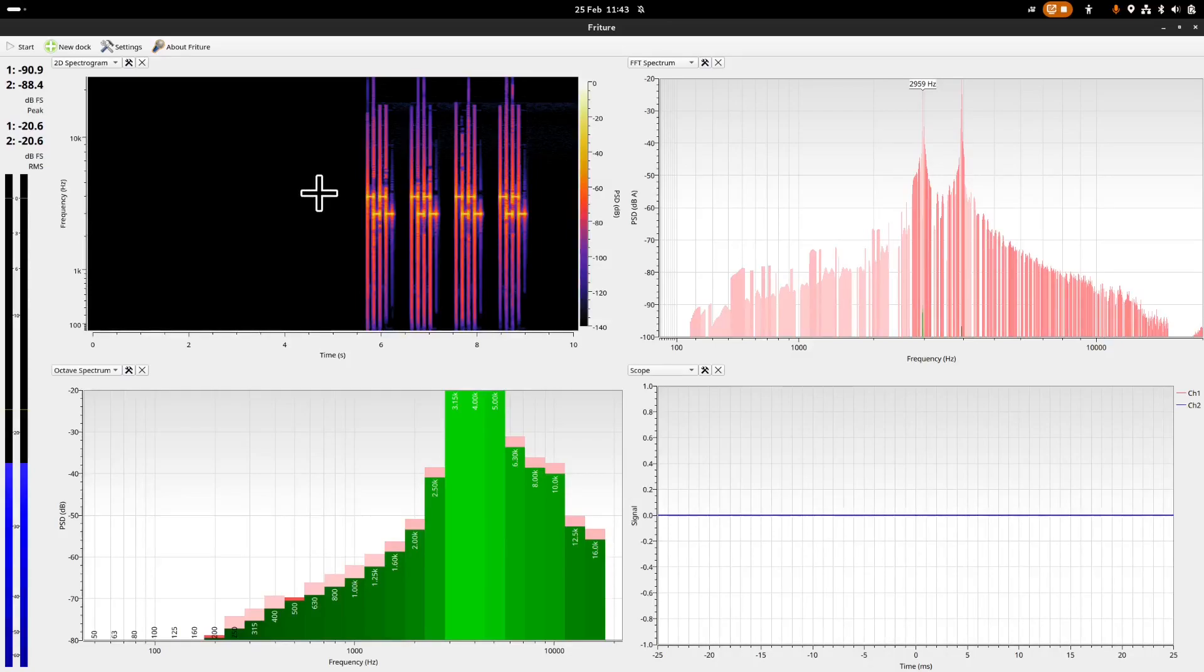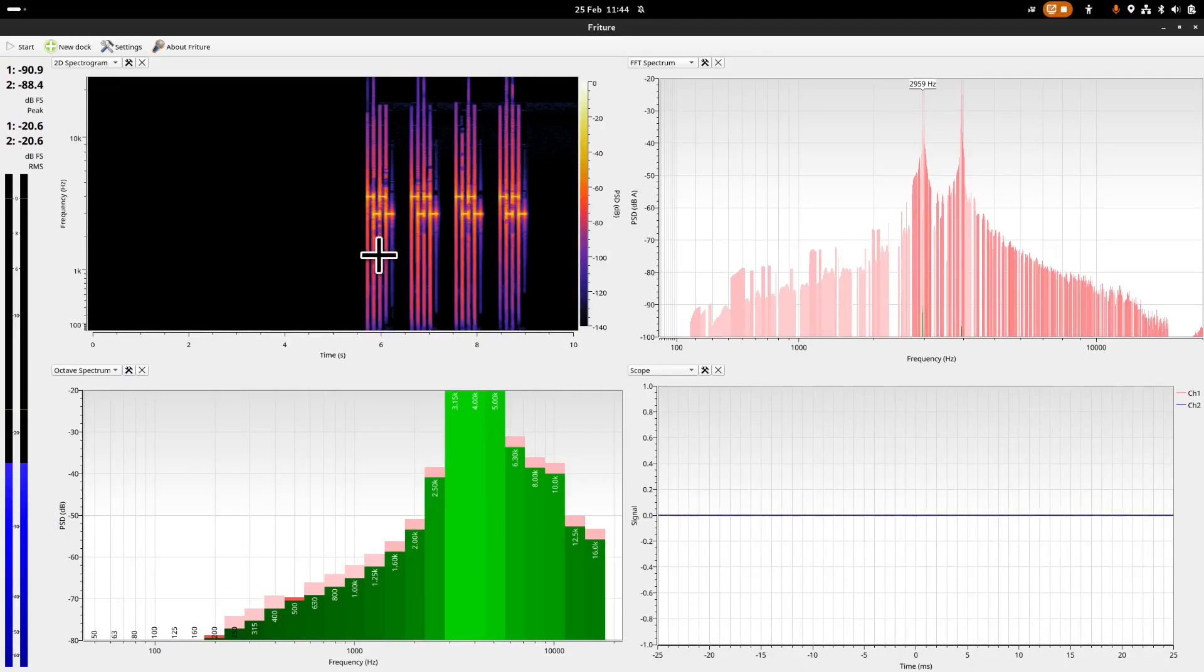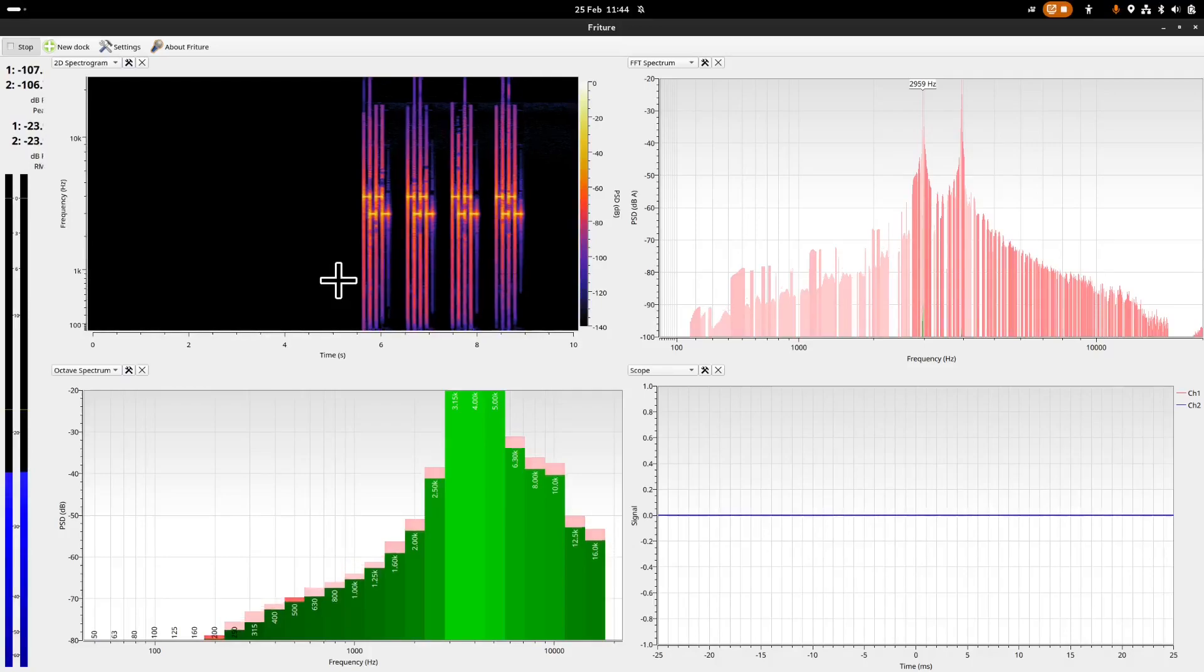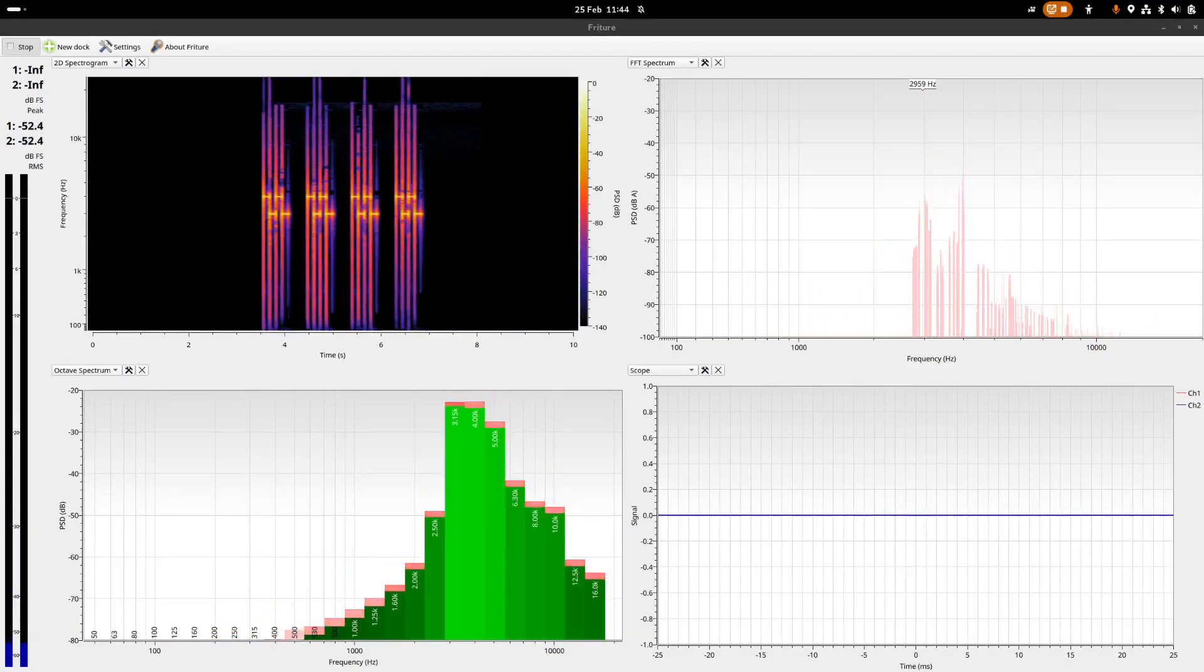So it goes high low high low pause, high low high low pause, and so on. It goes relatively rapid. And now let's compare that with their high alarm sound.